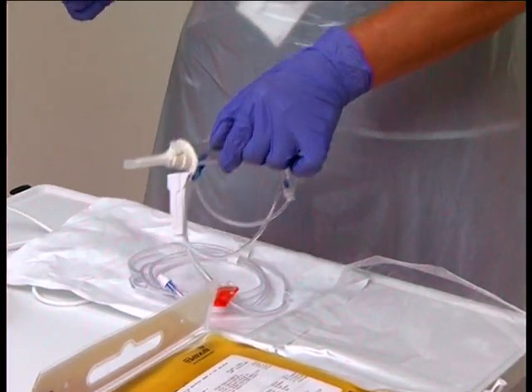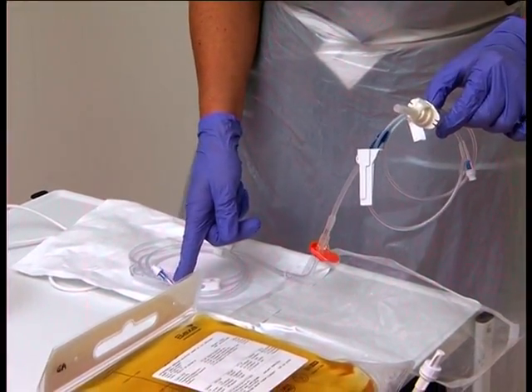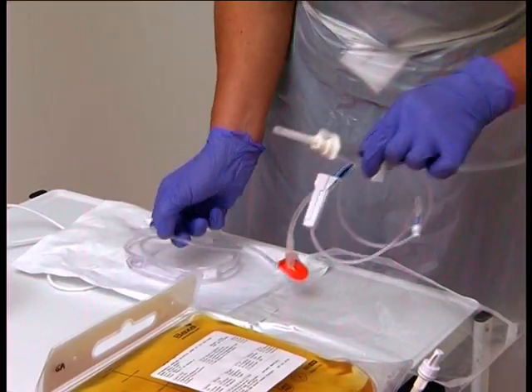Lift the giving set chamber off the paper, taking the spike and top portion of the set with it. The smart site left behind on the packaging is the part that you need to connect to the fat giving set.